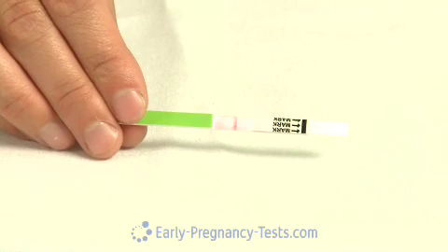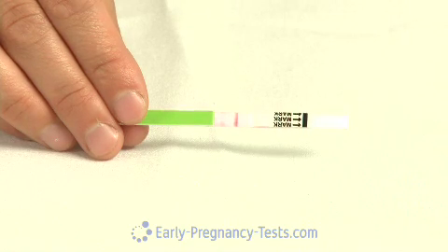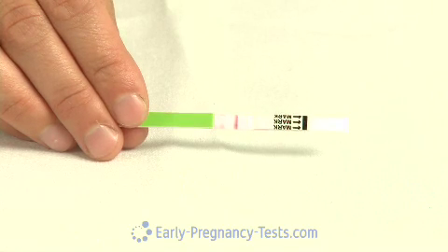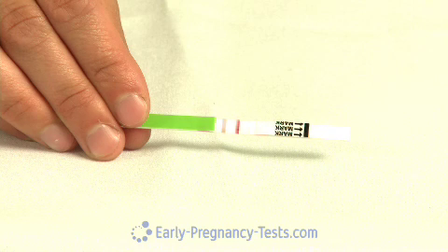The test instructions indicate that you should hold the test in the urine sample for about 10 seconds. Our personal preference, however, is to hold it in the sample until you see the dye begin traveling up the test, which usually happens within 10 seconds. At this point, you can lay the test on any flat surface.